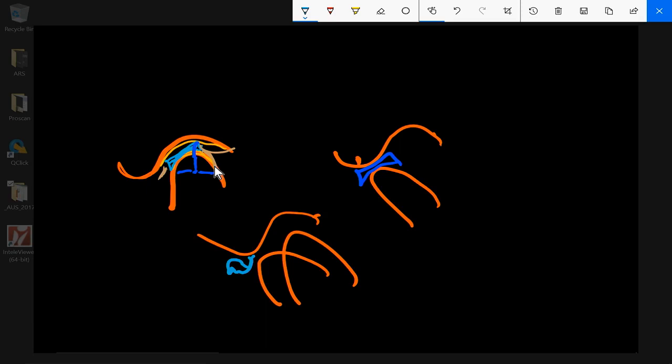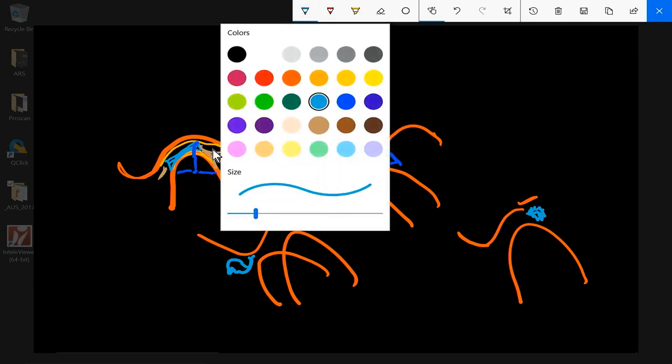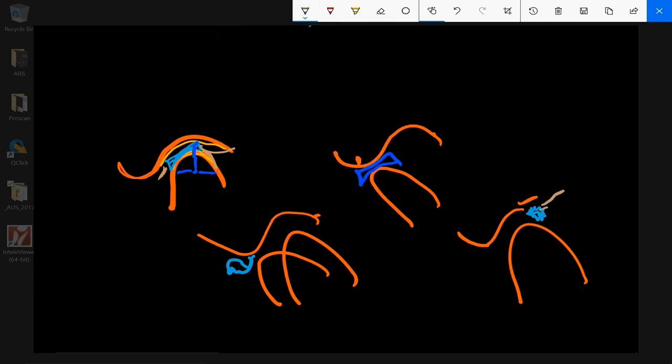What happens if the meniscus has busted, these ligaments have torn, they have rolled up in a ball? Let me make a new picture. Our meniscus, which we'll make aquamarine blue, is now back in here because the brown attachments, the upper attachment, and or the lower attachment, have busted.